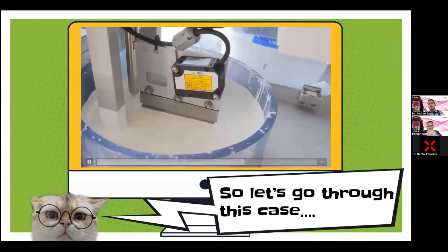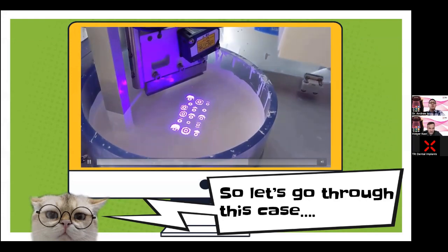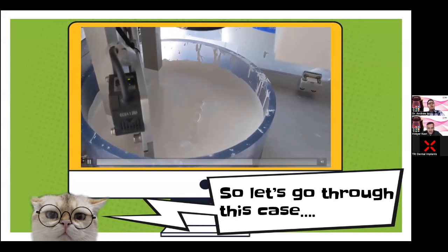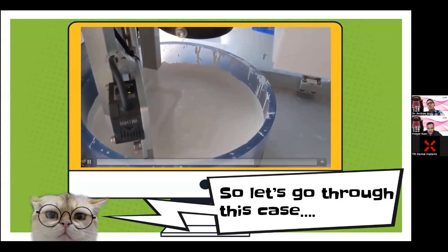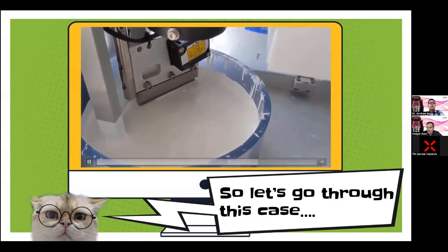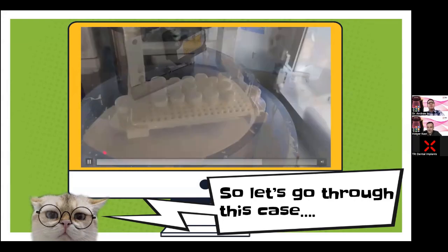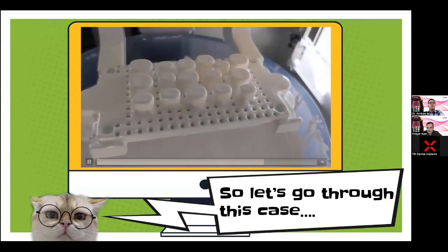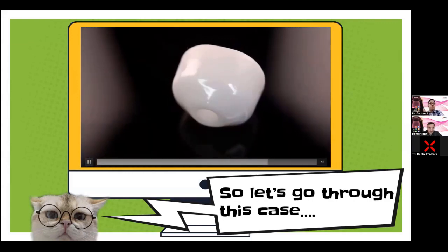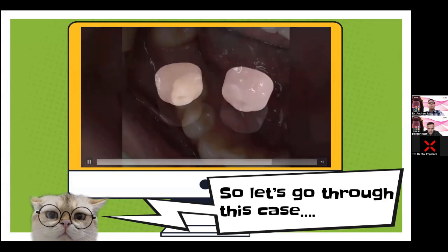But I mean, it looks nice. In a nice, simple case like this, you get great soft tissue adaptation. It looks great. But yeah, these days I tend to get similar results, if not the same type of results, with printed resin rather than printed zirconia. But it's nice. I have a zirconia printer, so why not use it? So that's after it's fully polished. You can see how nicely polished zirconia can become.